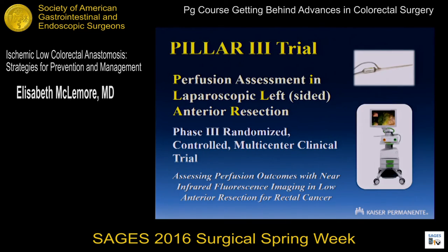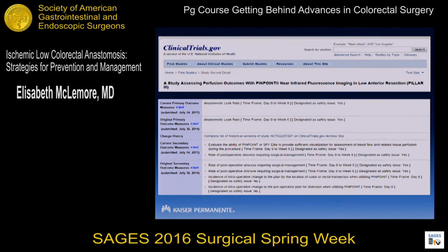So to follow that up, we're in the middle of the PILLAR 3 trial led by Mike Stamos and Steve Wexner using the laparoscopic camera to evaluate your perfusion, but you can actually perform the surgery open, robotic, laparoscopically, transanal, total mesorectal excision. It's your choice. The anastomosis has to be anywhere from 10 centimeters from the anus to the anus. You just have to actually make an anastomosis for the trial. So here's the information here.